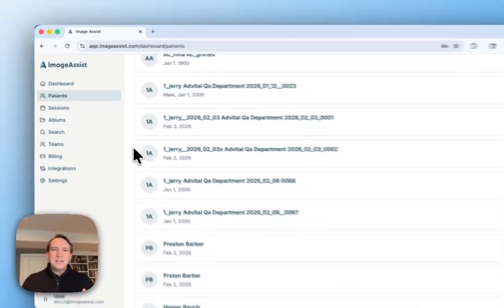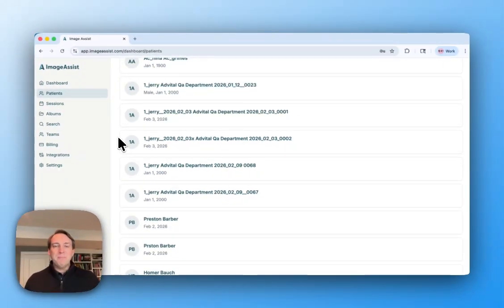So we're so excited for you to have this new web app and the new albums feature. We would love any feedback that you have. We're always trying to make our platform better to speed up workflows and make clinical photography more efficient and more productive for our customers.